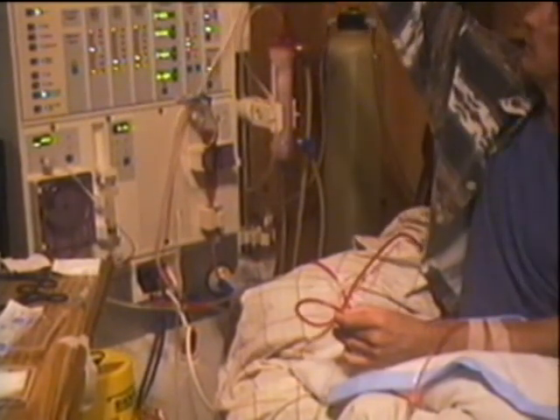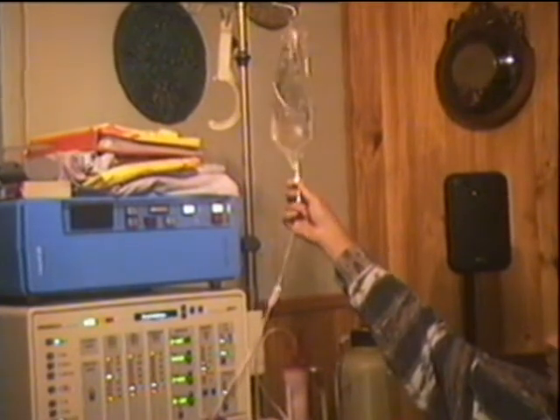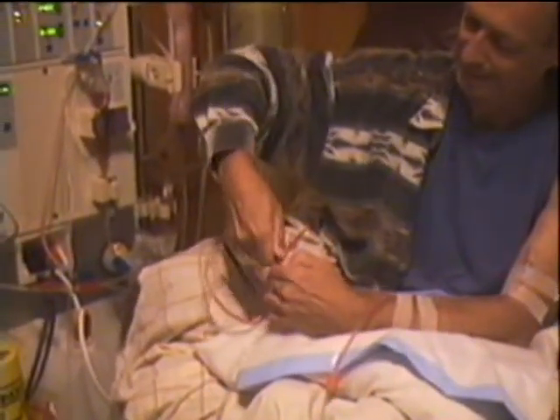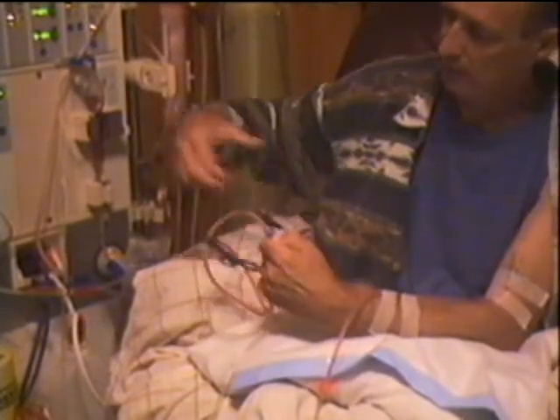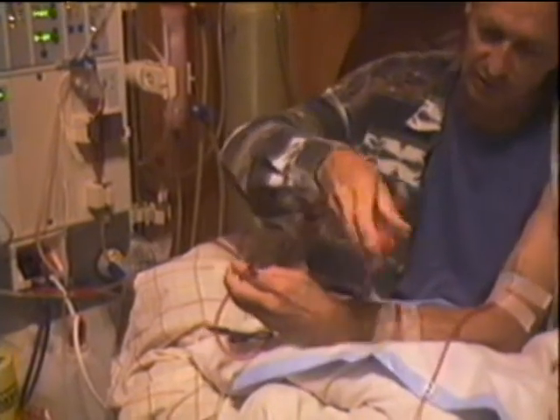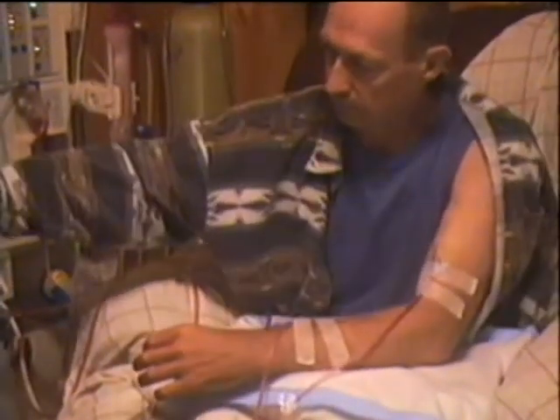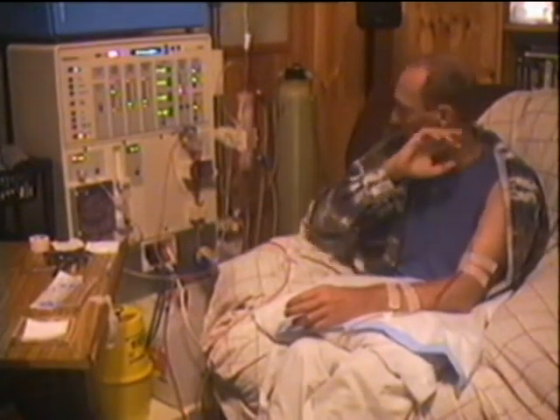The saline bag is nearly half empty. Now that's enough, so I'll stop it. I'll clamp that and disconnect it — clamp both ends on the venous. Sometimes they stick and you have to use metal clamps to undo them. It's off. Now I'll cap that one — so now I'm disconnected. Just to complete the circuit, we'll put that on where the saline goes in, and that way nothing can escape from all these tubes — they're all completely sealed. When I finish, all this comes off and goes into the rubbish bin.